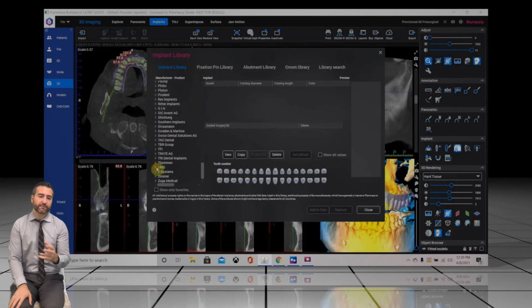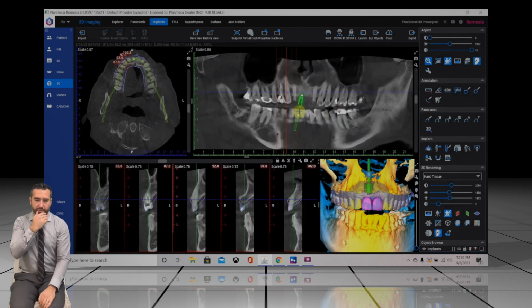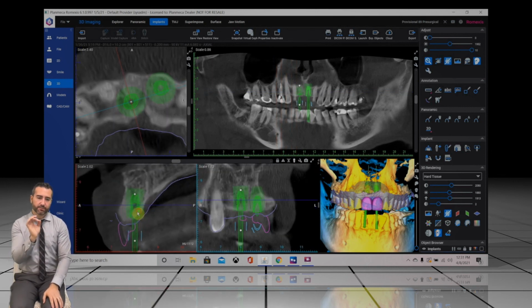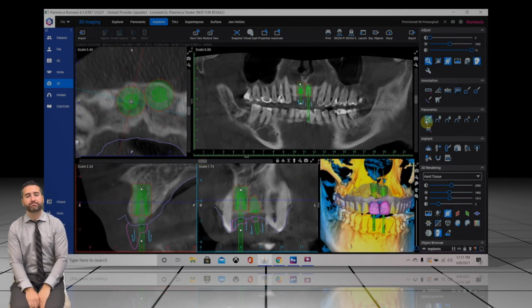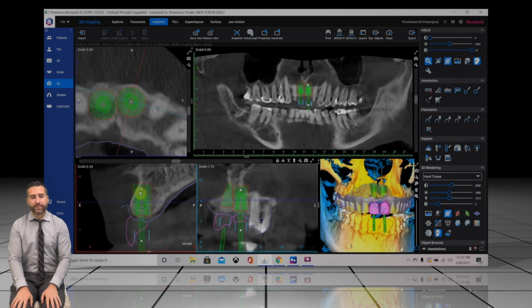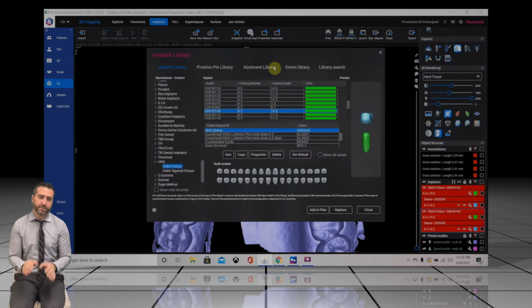So here we go. I'm virtually placing the implant, literally hundreds of implants to choose from. You could go ahead and place your implants here. You could parallel them, implant centric view to make sure that everything's within bone, that in this case your screw access ports are going to be coming out the cingulum of your restorations that you waxed up. And so here we can see I'm measuring to make sure that everything's okay. And paralleling to the other side. This is just routine stuff.